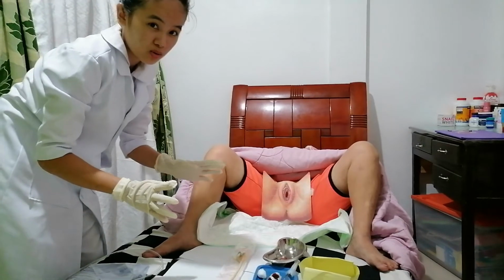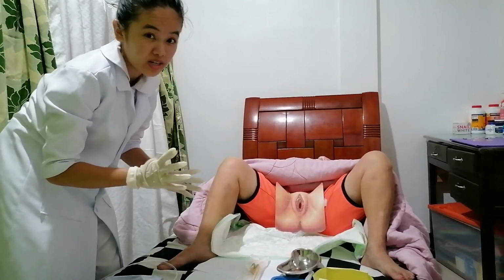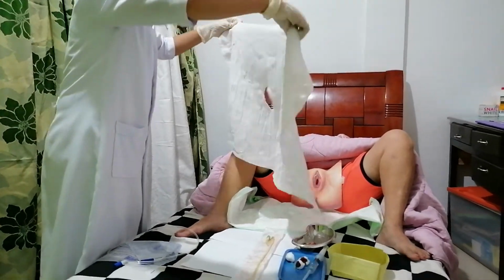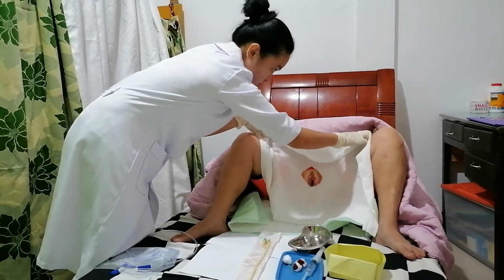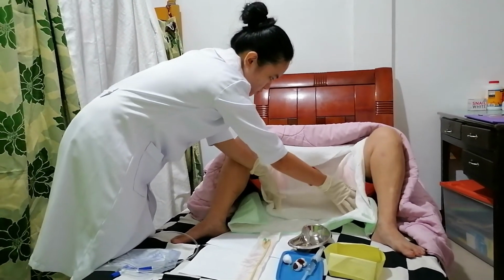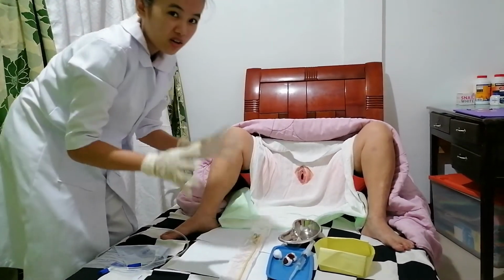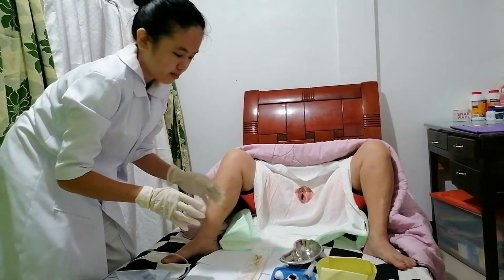After that, I'm going to put the second drape into the patient's perineal area. So the rationale behind that one is to provide more sterile area.